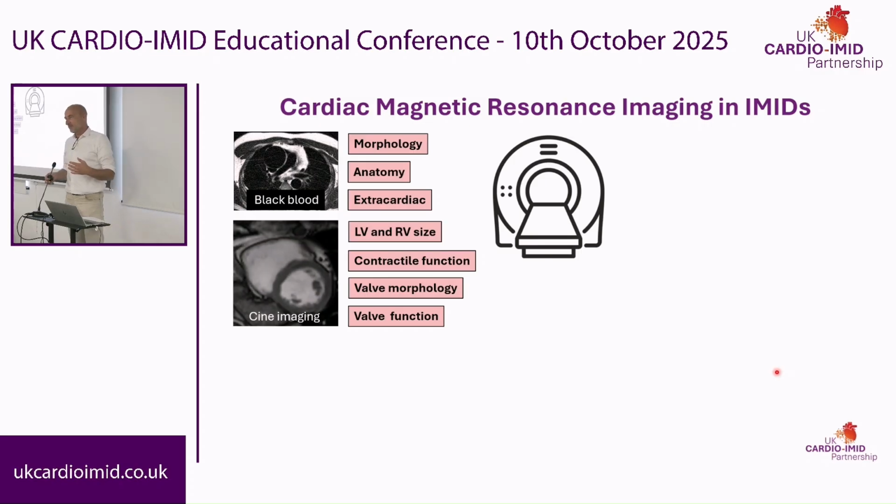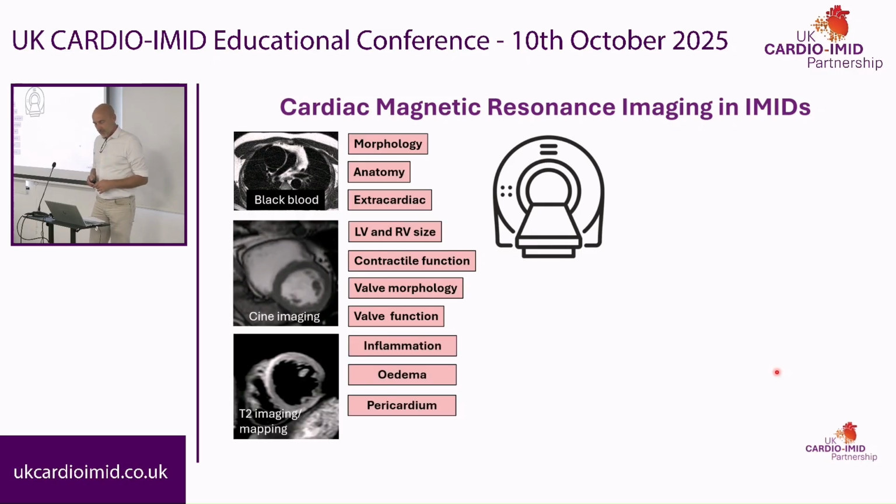Leaving aside arrhythmias and poor breath holding, and even for those we now have ways of overcoming that, you get outstanding pictures with great signal to noise ratio, blood myocardial contrast in every patient for the left ventricle, the right ventricle, atria. There's no blind spots like in echo. There's no breast tissue attenuation. So the images are always, within reason, good quality.